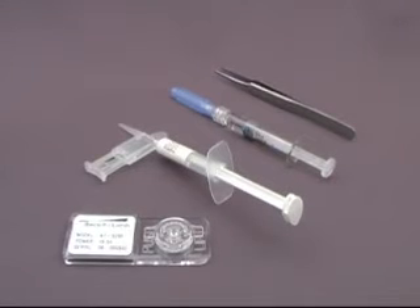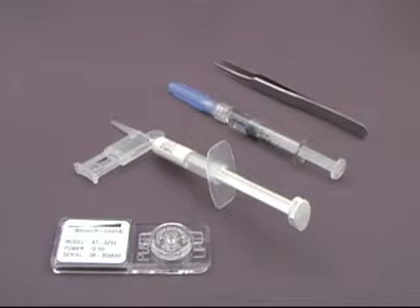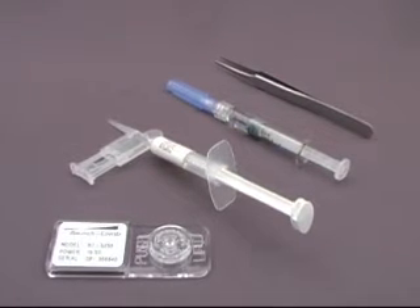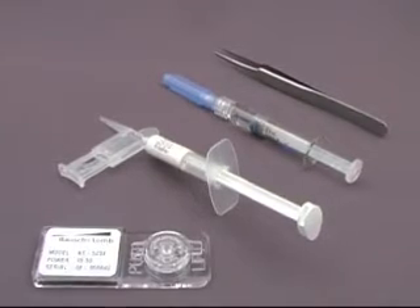We begin with a CrystalLens of appropriate model and dioptric power, a CrystalCert Delivery System, Bausch & Lomb AmVisc Plus viscoelastic, and a pair of non-tooth forceps.